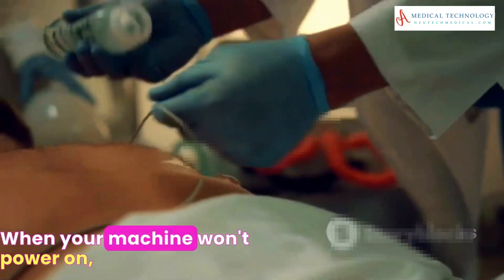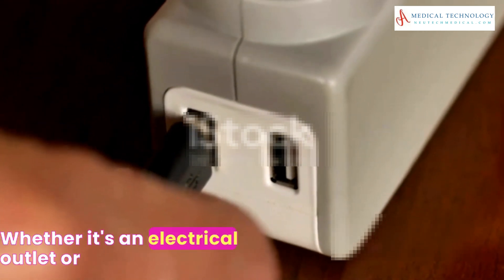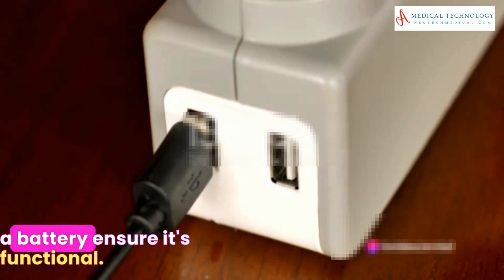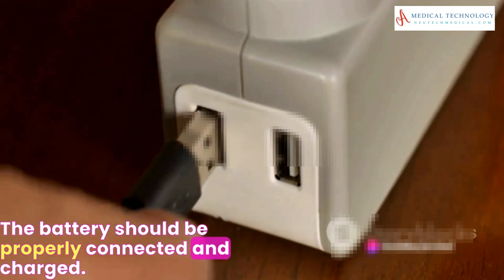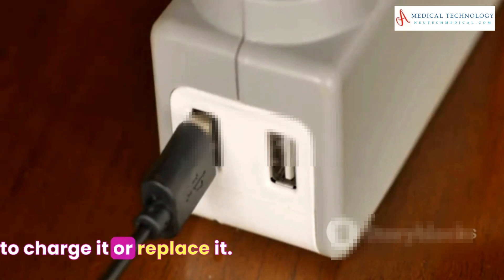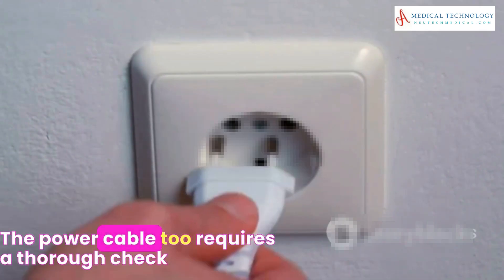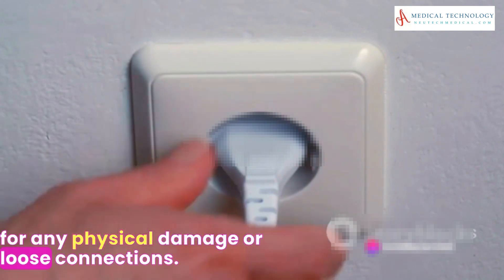When your machine won't power on, start by inspecting the power source. Whether it's an electrical outlet or a battery, ensure it's functional. The battery should be properly connected and charged. If not, take the necessary steps to charge it or replace it. The power cable, too, requires a thorough check for any physical damage or loose connections.